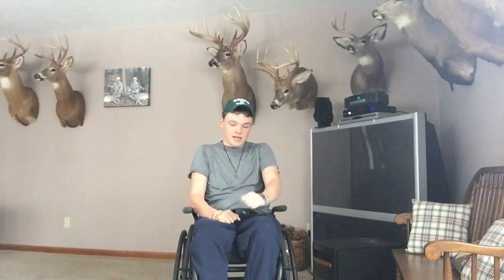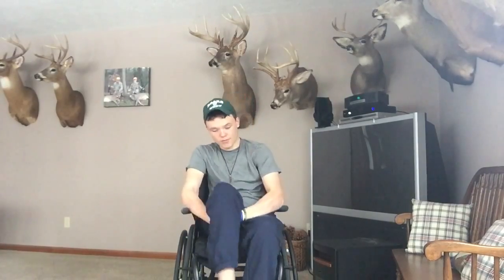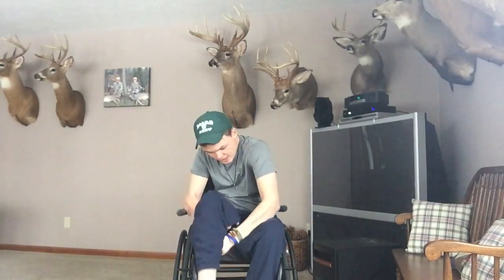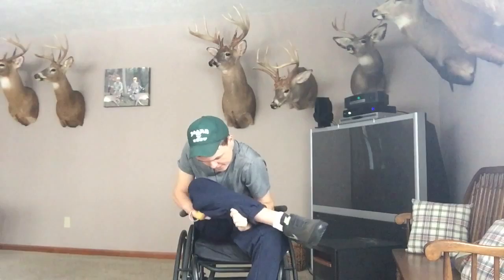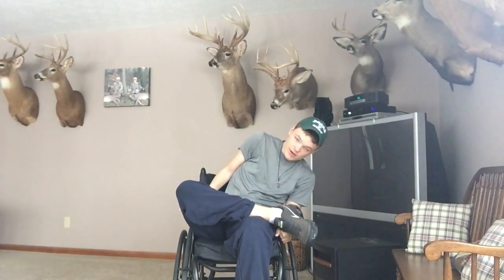The next way to do a pressure relief in a manual chair is kind of the same as the last one, where you cross your legs, but this time you are just going to bend it and put it over your knee. So I will show you right here. So you want to go like this and keep it like that. And then you can lean over this way to relieve more pressure.